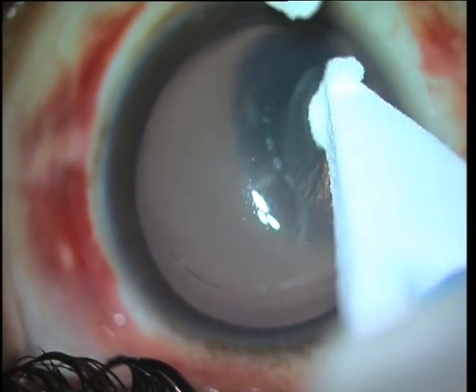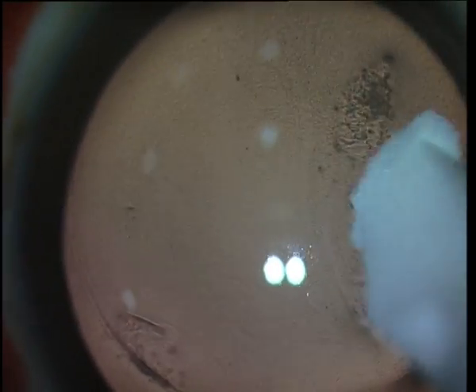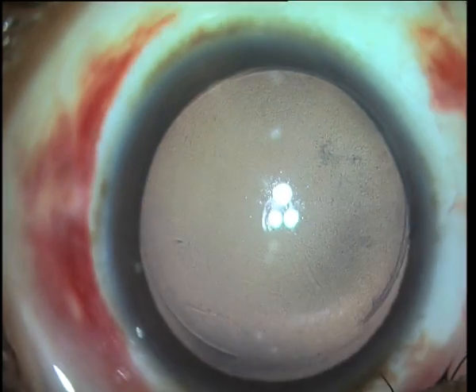You can see that the striae are much less now than they were at the beginning of surgery. Striae that do not respond to this treatment may require a debridement of the epithelium followed by stretching. Late striae may even require suturing or the ironing technique as described by Donenfeld et al.